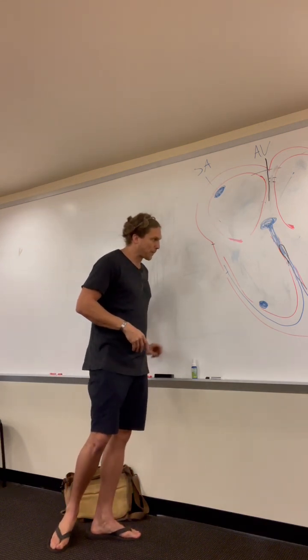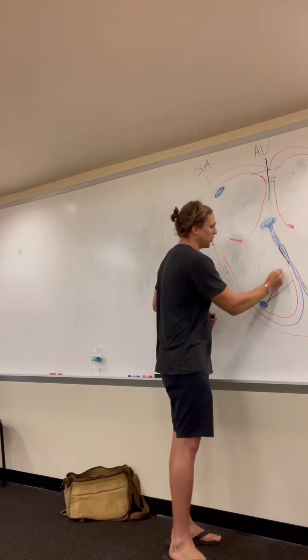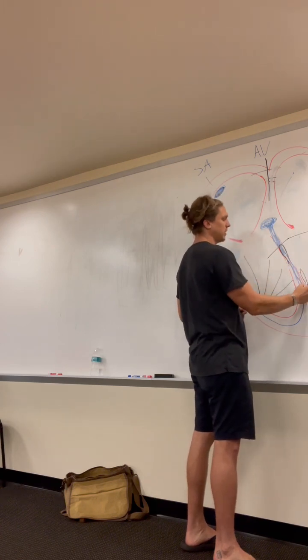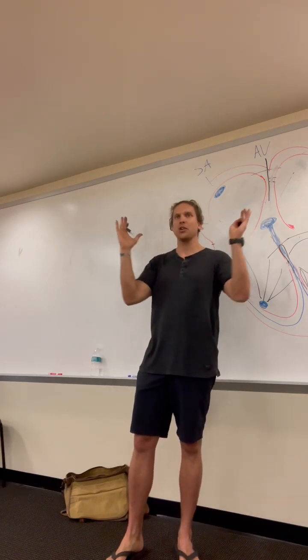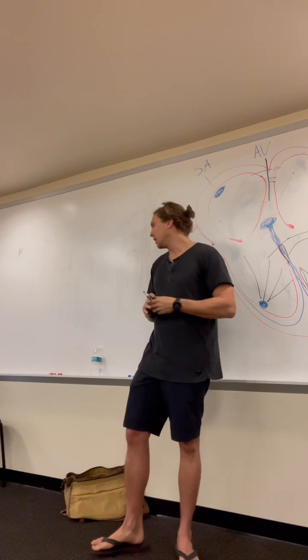And then remember that this rhythm doesn't follow the normal pathway of conduction, so it takes longer to get over here and go all the way around here and wrap around this way and finally depolarize all these cells in the heart, so it makes a wide QRS. And as soon as that one QRS is done, the next one's coming, okay? The body's trying to keep itself alive.